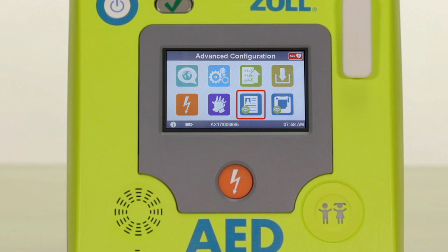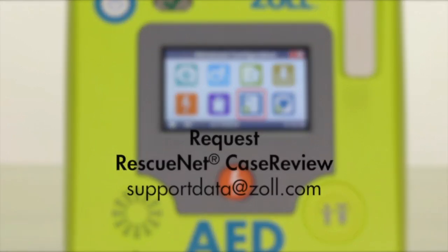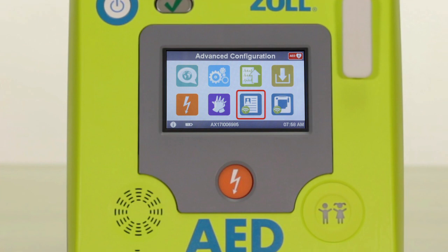The blue report icon with the green Wi-Fi waves icon is where you set up your Wi-Fi connection for transmission to Zoll Case Review, should you wish to access case data such as ECG and CPR performance. Note that you will need a Case Review account to do this. Zoll offers Case Review Basic free of charge for AED3 users. You can request a free Case Review Basic account by contacting Zoll support at supportdata@zoll.com.